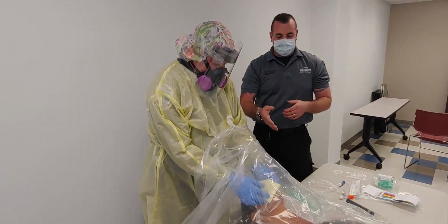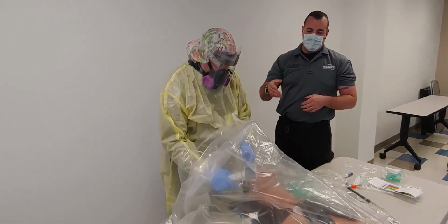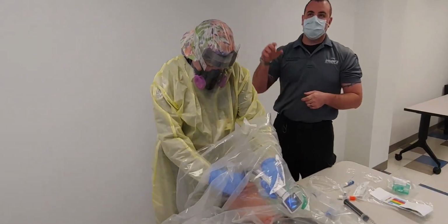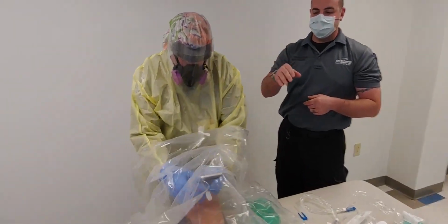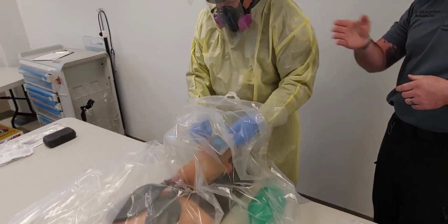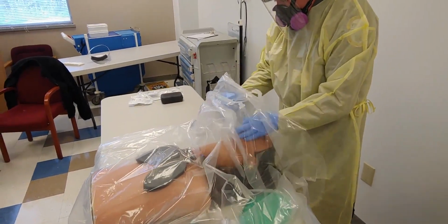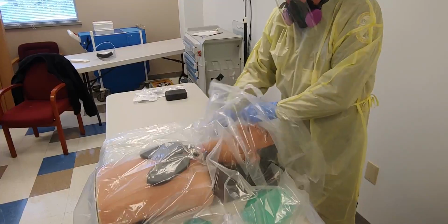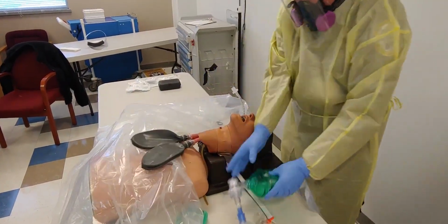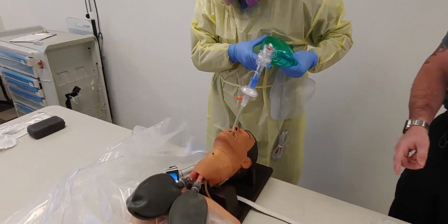So Brian's going to go ahead and proceed with the intubation, removes the non-rebreather and the procedure mask, uses our King Vision. Now this is a very well lit room and there's no glare on the plastic. It doesn't inhibit his vision at all. He successfully intubates the patient. Inflates the balloon as you normally would. At this point he attaches the BVM with the viral filter and the end-tidal.